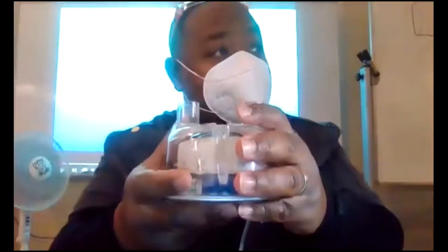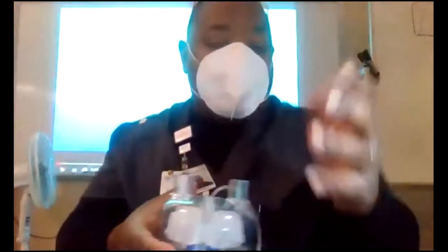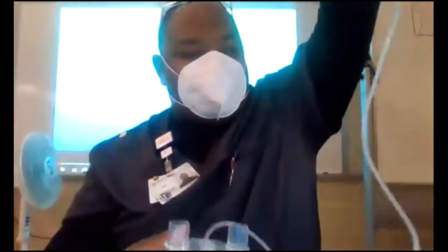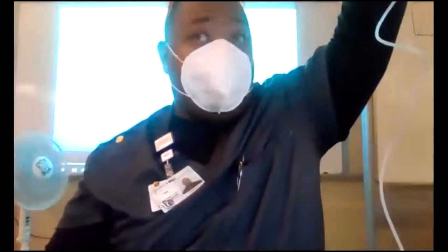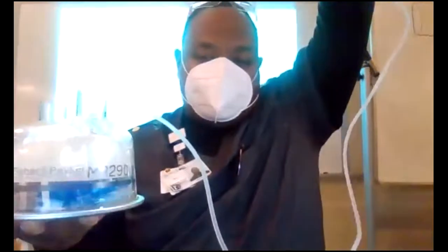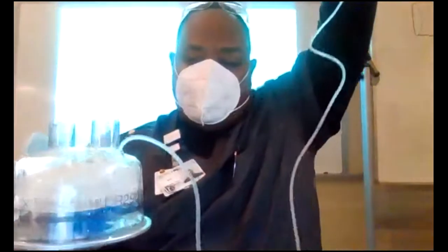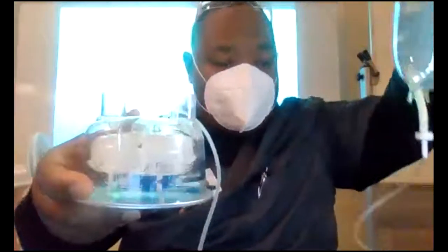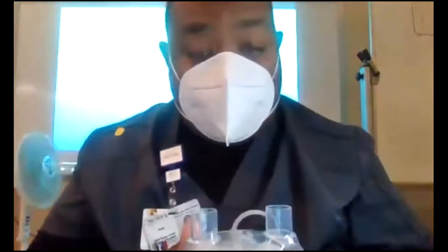It's going to have a higher potential because of the heat, right? And so if I have room air going through here, it'll pick up a little moisture. But if I heat this to 37 degrees, now it's going to have the potential to pick up and hold a lot more, right? And so this is how it's being fed. It's a feed apparatus. Make sure you know, it's called a feed apparatus, because that will be on the test. And it just constantly pours water in there. Gets to a certain amount and it kind of holds up a little bit. And it will just constantly feed into your Passover or your cascade humidifier.